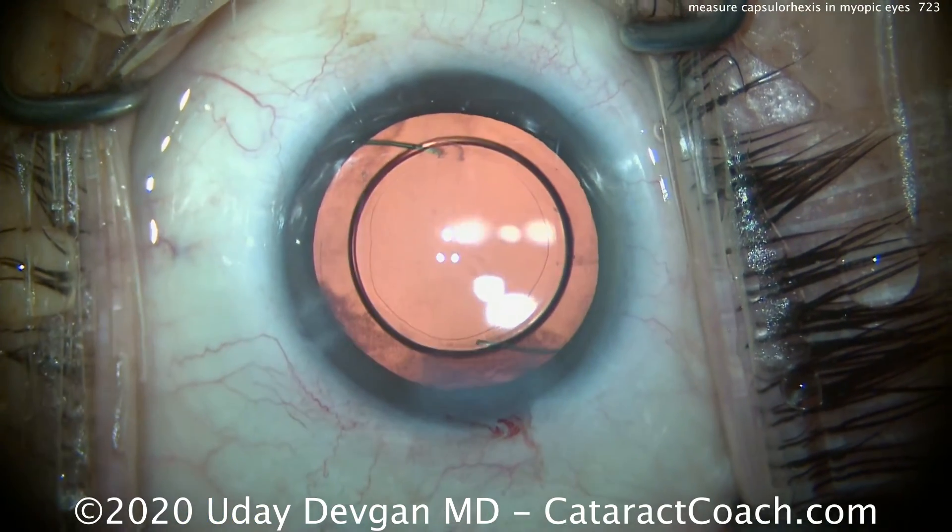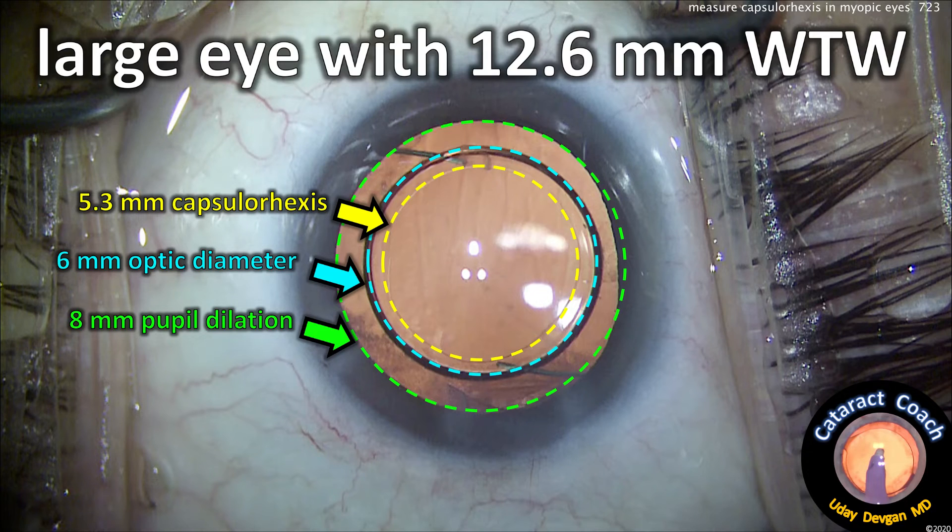Let's take a look at the very end. Here's a picture with an overlay: we ended up with an 8 mm dilation, a 6 mm optic, and the capsulorhexis turned out to be about 5.3 mm as measured at the end of the case — exactly in the middle of our target range of 5 to 5.5 mm. It's a big eye with a white-to-white of 12.6 mm. This patient had a beautiful outcome and is very happy.